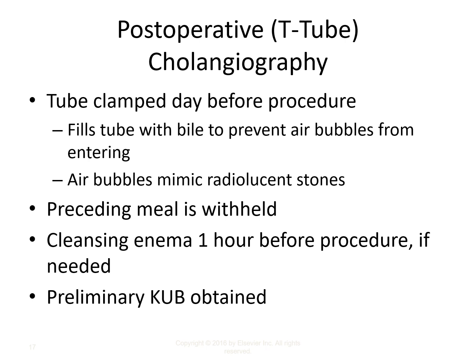Typically that is to clear any stool contents out of the large colon because the hepatic flexure sometimes overlaps and the transverse colon overlaps with the biliary system, and if there's a massive stool there, it might obscure adequate diagnosis of the biliary system because of the superimposition. So ideally, the large colon is cleaned out prior to your cholangiogram.